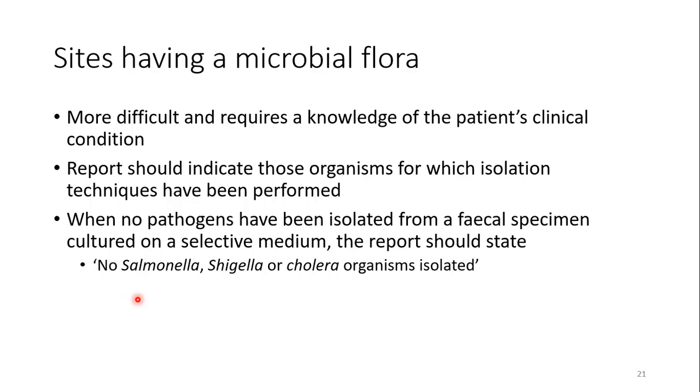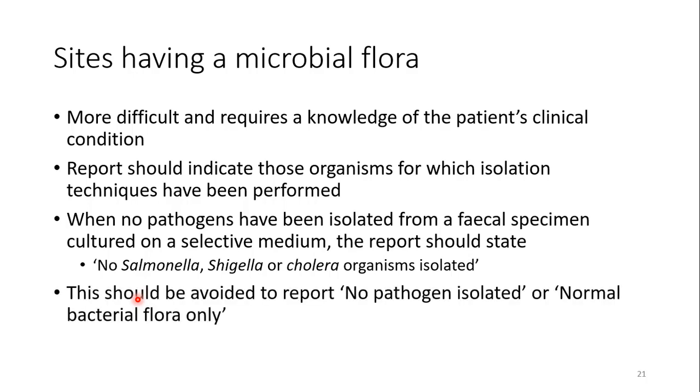If no pathogen is isolated from the specimen, for example, a fecal specimen on a selective medium, then the report should state that no Salmonella, Shigella or cholera organism is isolated, because usually the fecal specimen is cultured for Salmonella, Shigella or cholera on a specific selective medium.